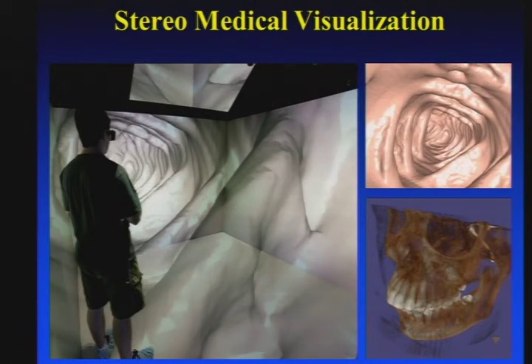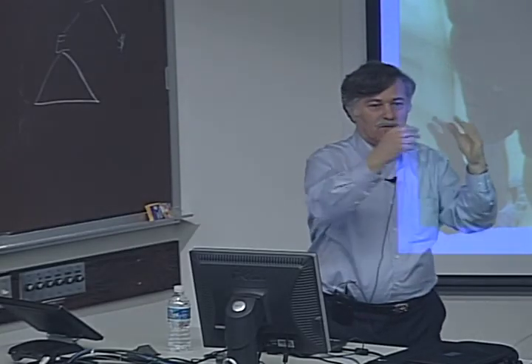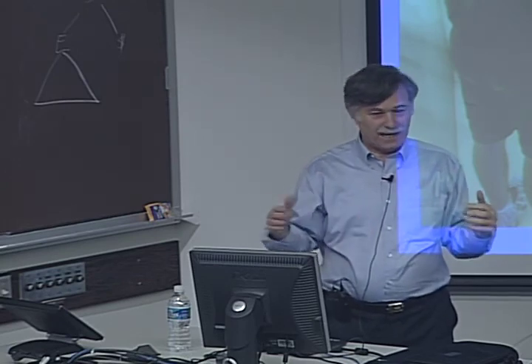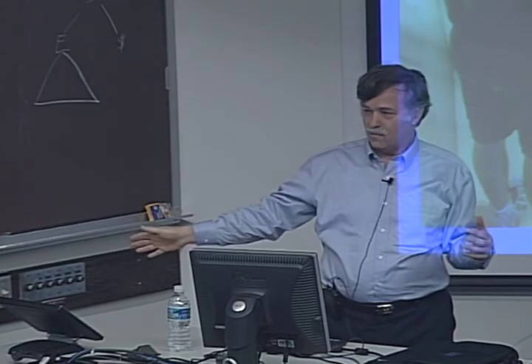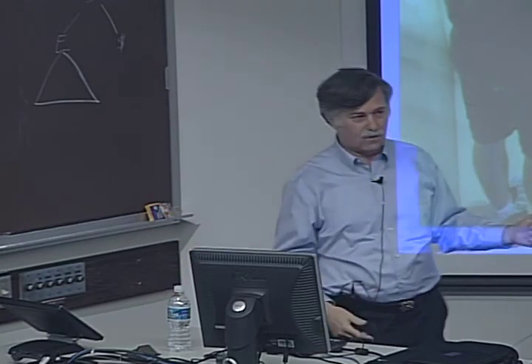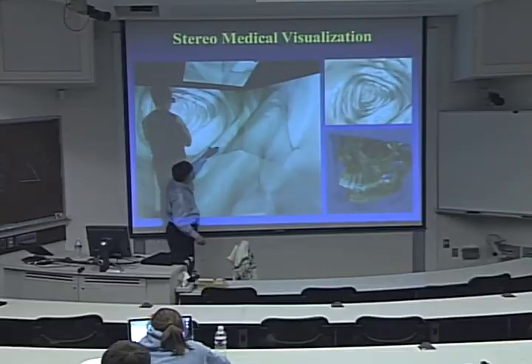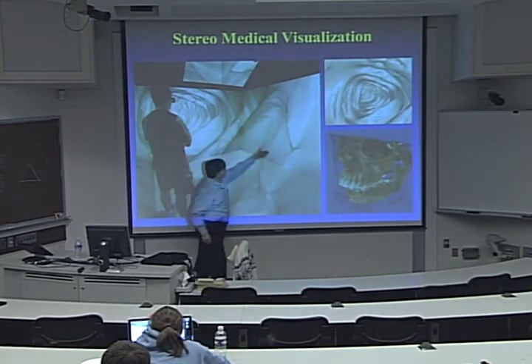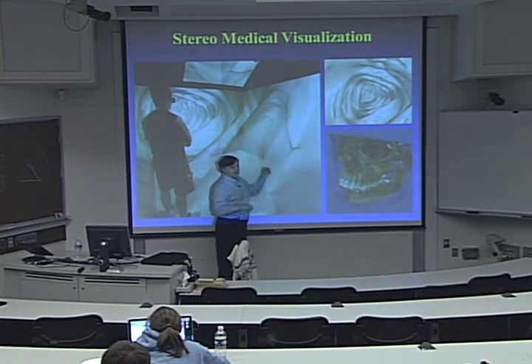I'll describe it in a minute, but why this is very helpful. If you remember, if we look at the frontal view, we may miss polyps which are behind folds or around sharp bends. If we have a way to look at the right wall or the left wall or the floor, every time that this polyp is behind this fold and we missed it here, when it gets to this point, we're going to be able to see it.